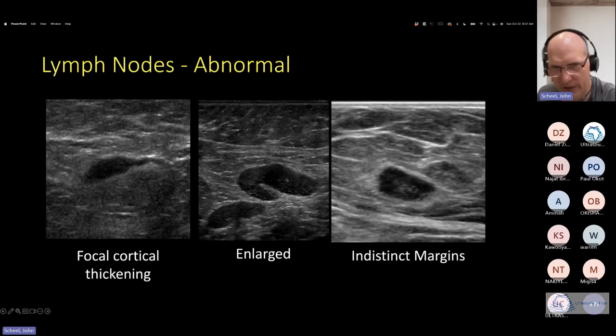Here are just standard lymph nodes that are enlarged. Many, many things can do this. Tuberculosis can do this. COVID can do this. And if you choose to biopsy them, when you're making that decision, you might choose to look at the other armpit. And if you see that their lymph nodes look the exact same, you probably shouldn't biopsy these. You probably should send them back to their primary care provider to have a workup. And if they can't find anything wrong, like tuberculosis or COVID, then they might ask your help to biopsy these to rule out lymphoma.